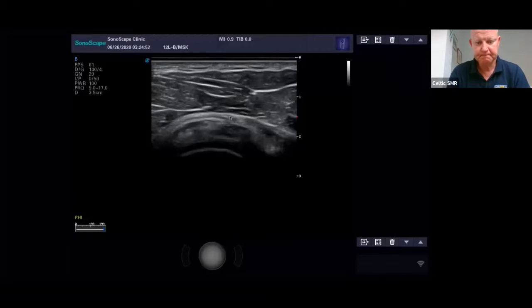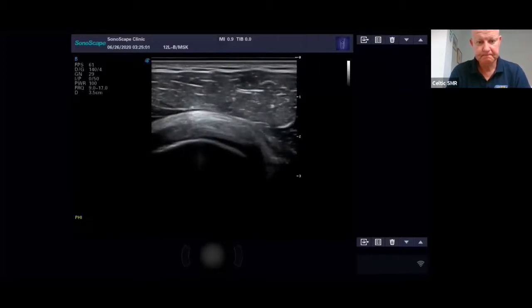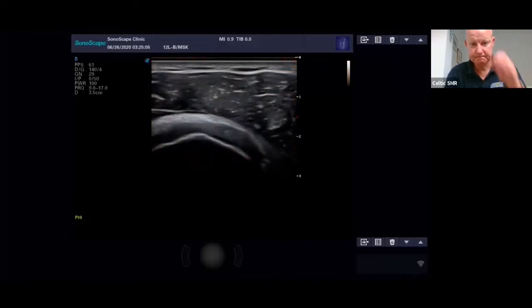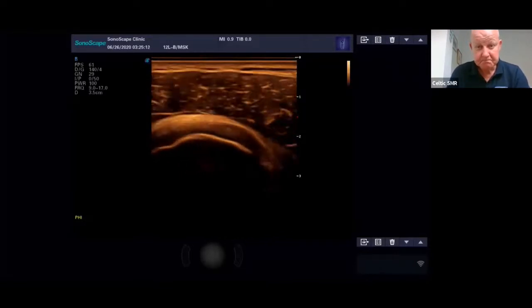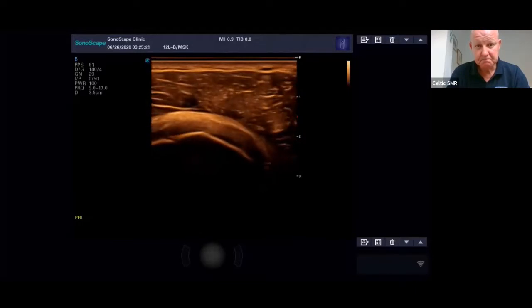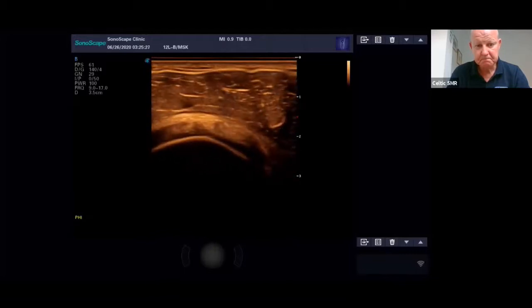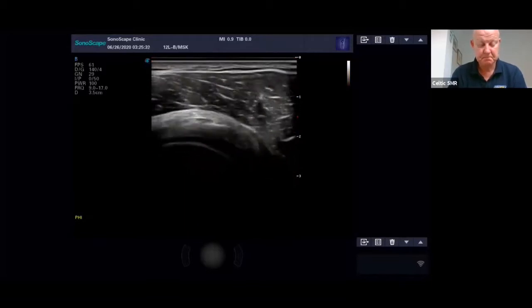Right. So there are other things that you can change to help you differentiate tears. On here, it's the chroma maps, and if you look at your screen, you can see the color changing. Sometimes your eye is better attuned to this sort of color, and you can pick out a lot of tears just simply by changing the color map. That's something you just have to play around with and get used to. It's quite good, if you're unsure looking at the one screen all the time, to just change the color map, and it might highlight some other things for you.